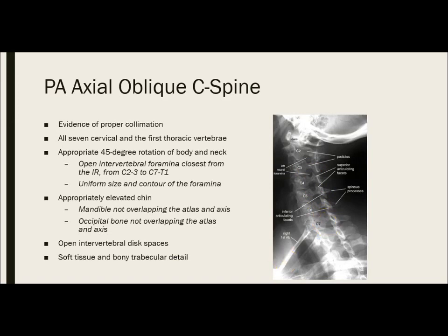Okay, and then we want to see appropriately elevated chin. So again, we don't want the mandible overlapping the atlas and the axis or the occipital bone. And then we want our open intervertebral disc spaces for here. Okay.